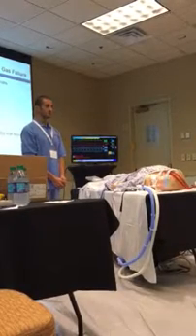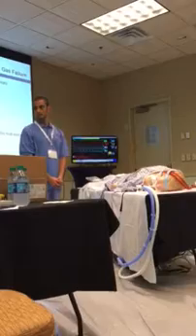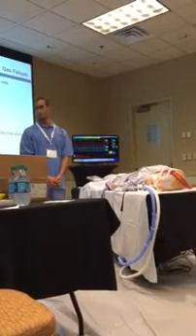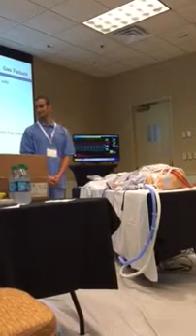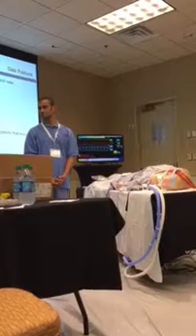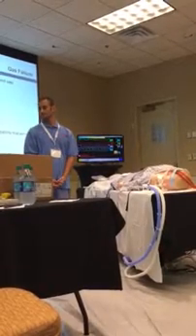Good. That's sort of what it should do. I think what I saw you do differently is you traced the line from the oxygenator all the way up to the source, whereas before you just eyeballed it. Plugged in, good to go. So I think that was the main difference that I noticed that you did, to really diagnose where the problem is.